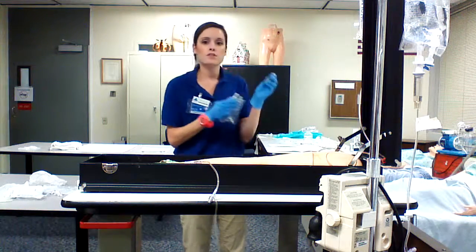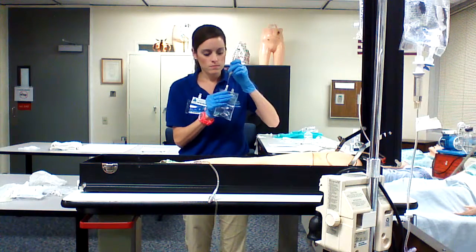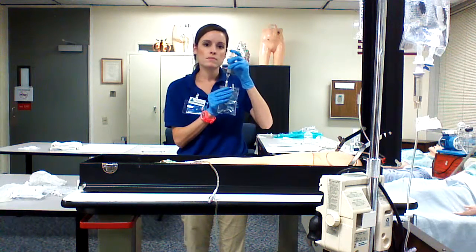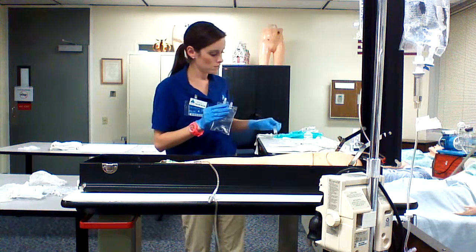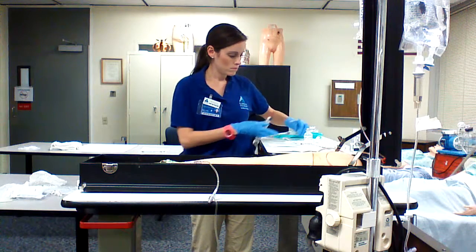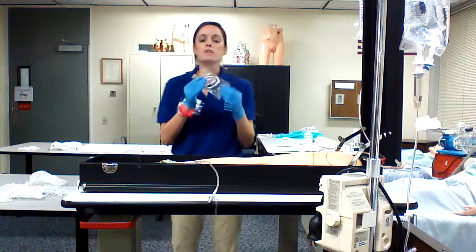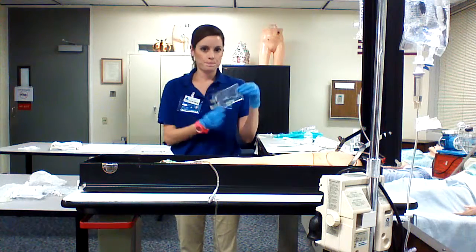And then I'll administer the vancomycin into the port. Okay, and I will carefully mix the medication in the solution.